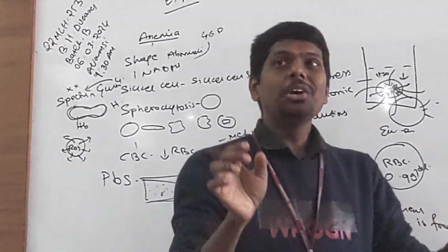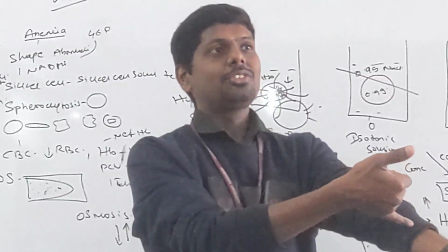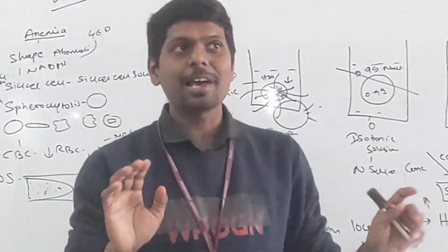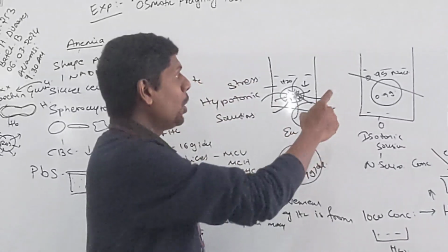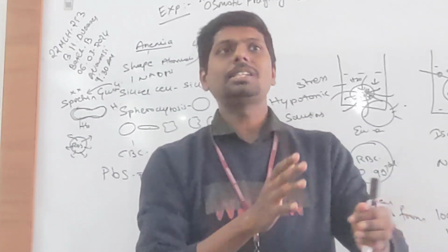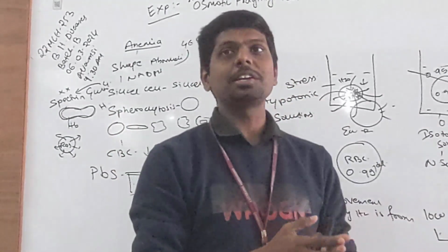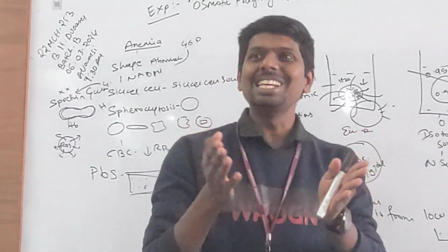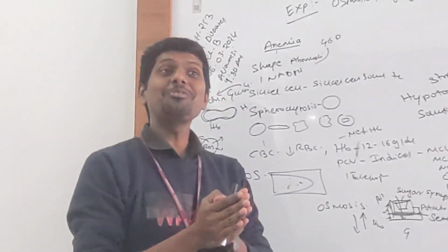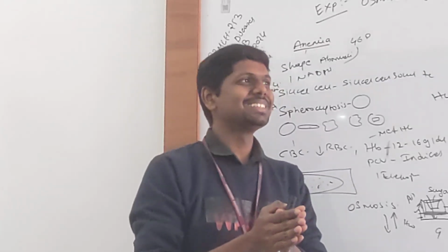By this analogy, try to understand, students, what if I give plain water instead of saline to a patient? Devastating effects. You understood, right? Water has low concentration. This water will enter the red blood cells and we will get hemolysis. The patient will die. If you want to kill a patient, replace saline with water. Game over. Okay, I cannot say these things. Even forensics cannot detect it, I guess, because water is not poison. Needle.